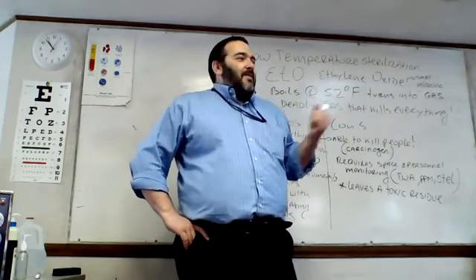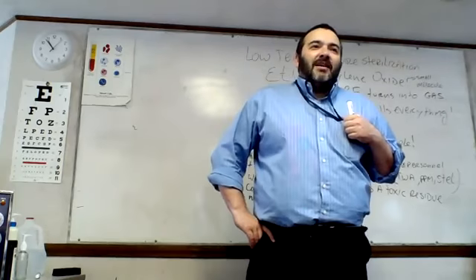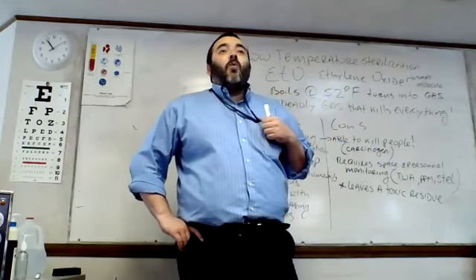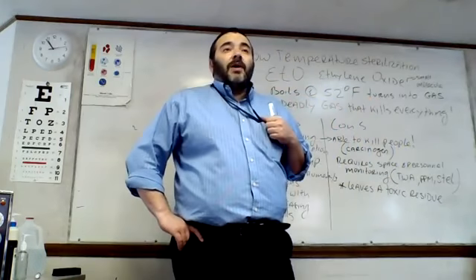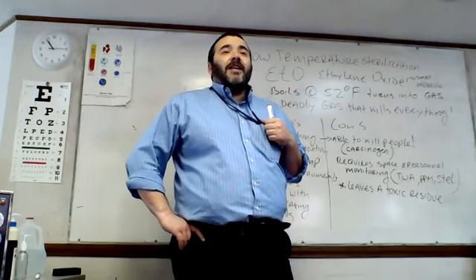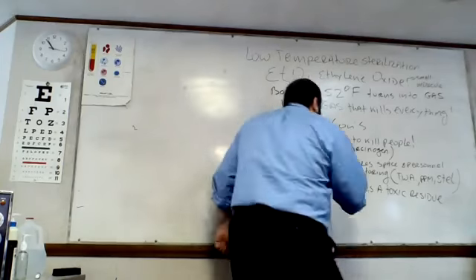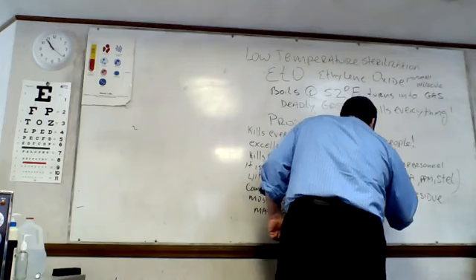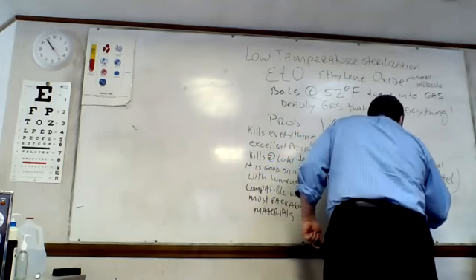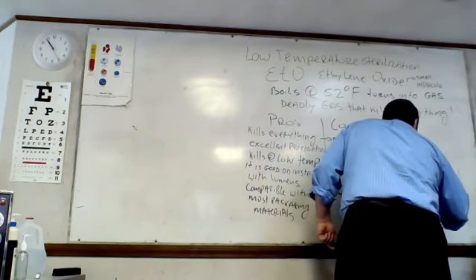Guess what? We have to do the same thing here. Okay? But we don't wash them after sterilization. Okay? To remove the residue, we will perform a procedure called aeration. Requires extensive aeration.